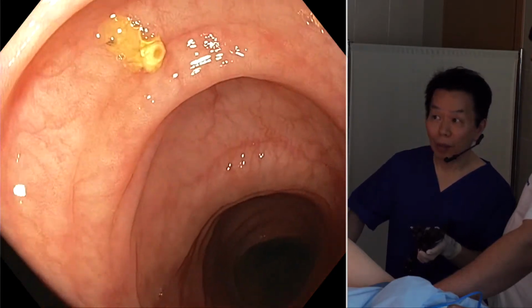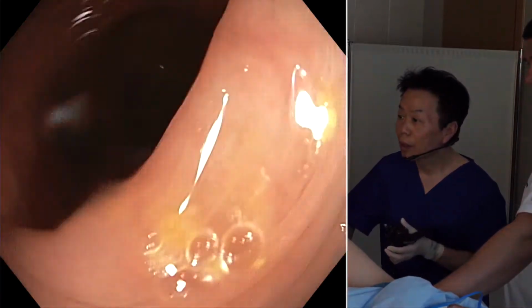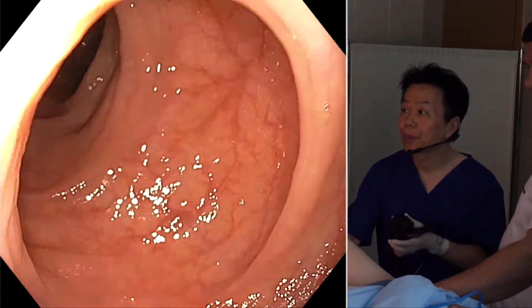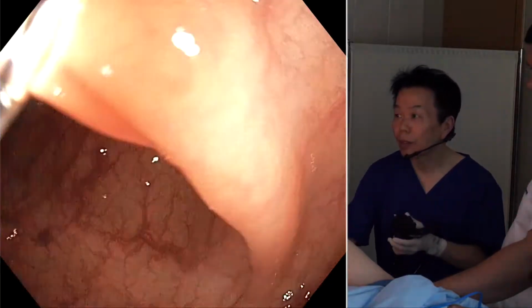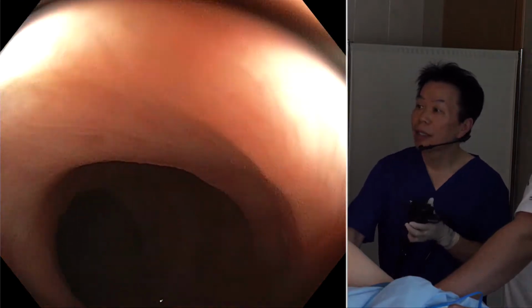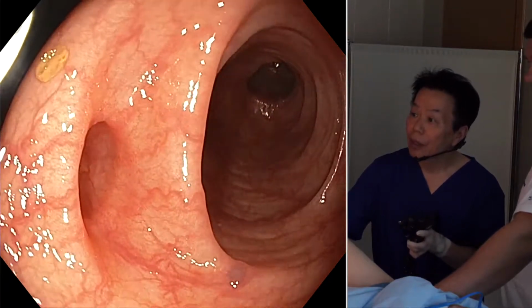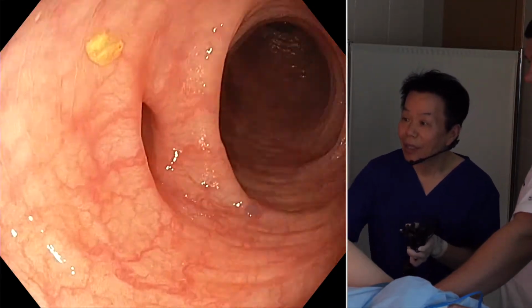Have you detected any polyps so far? No, I hope not. Now it's about 40 centimeters from the anus. It must be the descending colon, and we are approaching the sigmoid colon. So 3 years ago, she had a colonoscopy and nothing more than diverticula. So I think nothing was overlooked during the last colonoscopy.